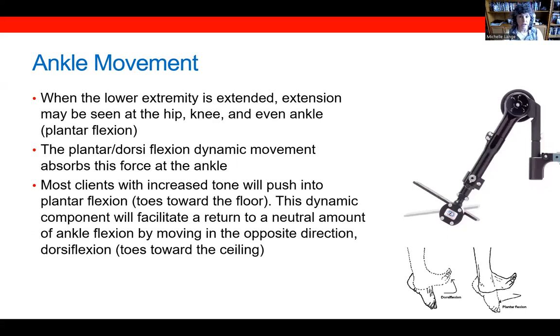Now, many clients, when they extend at the hips and the knees, will also extend at the ankle into plantar flexion. And by providing movement at the ankle, we can provide further force diffusion. And this might be more tolerated by the client. So most clients with increased tone will push into plantar flexion, and then the dynamic component at the ankle will help the client to return to a more neutral ankle position.